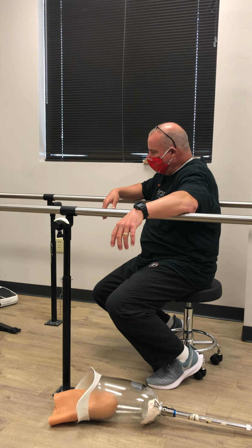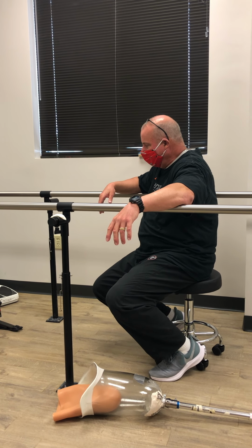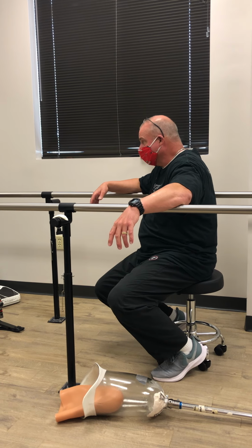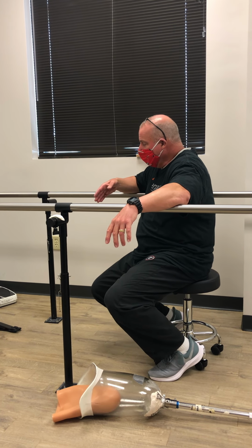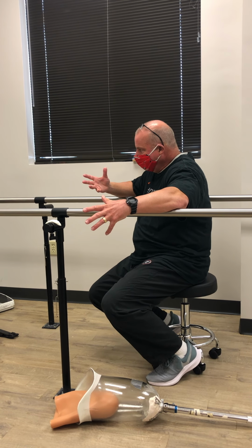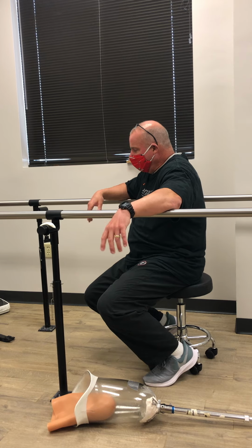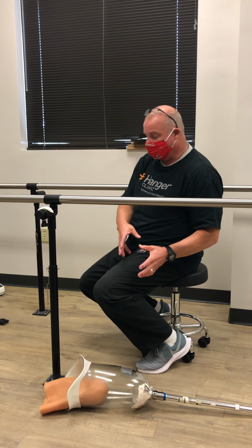So once again, I hate to say you need to stay within a certain weight, but you really do. It's easier for you to go down and us to accommodate it with socks. Going up, 5 pounds, at 5'7", we can probably accommodate, but you see how the socket fits.